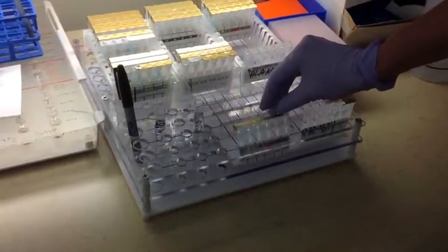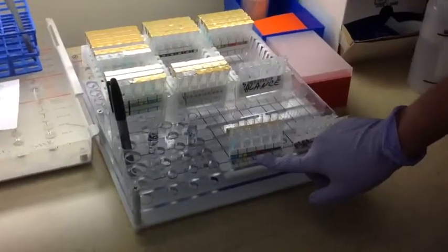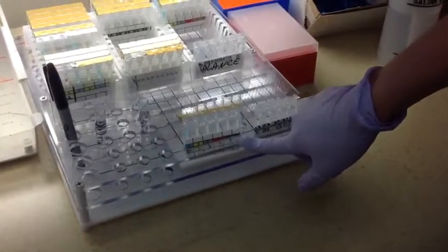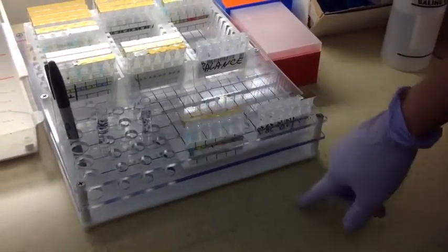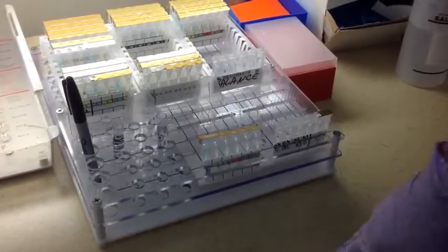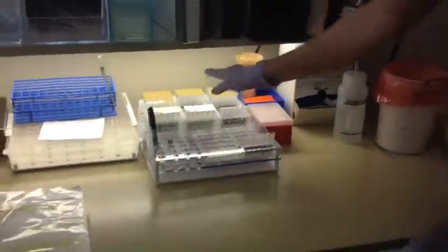So for a patient's blood type, we would use the patient's red cells for the A, B, and D reactions in the front type, and then we would use the patient's plasma in the back type for the A1 and B cells. And the front type and the back type should have opposite reactions. I don't have an example for you, but that is how we actually determine a blood type.